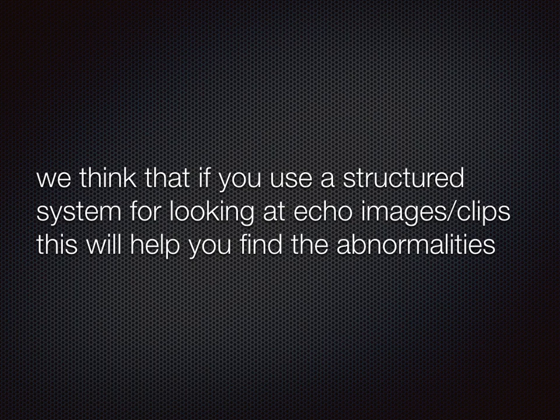Okay, so we think that by using a system such as a DEFG system, it means that in a pressured situation, you can yield the maximum amount of information out of echo clips and images in a shorter amount of time. Sometimes when you're faced with an overwhelming problem, it's easier to break it down into bite-sized chunks, and that's the philosophy behind this. So remember, D for dimensions and structure, E for effort, i.e.